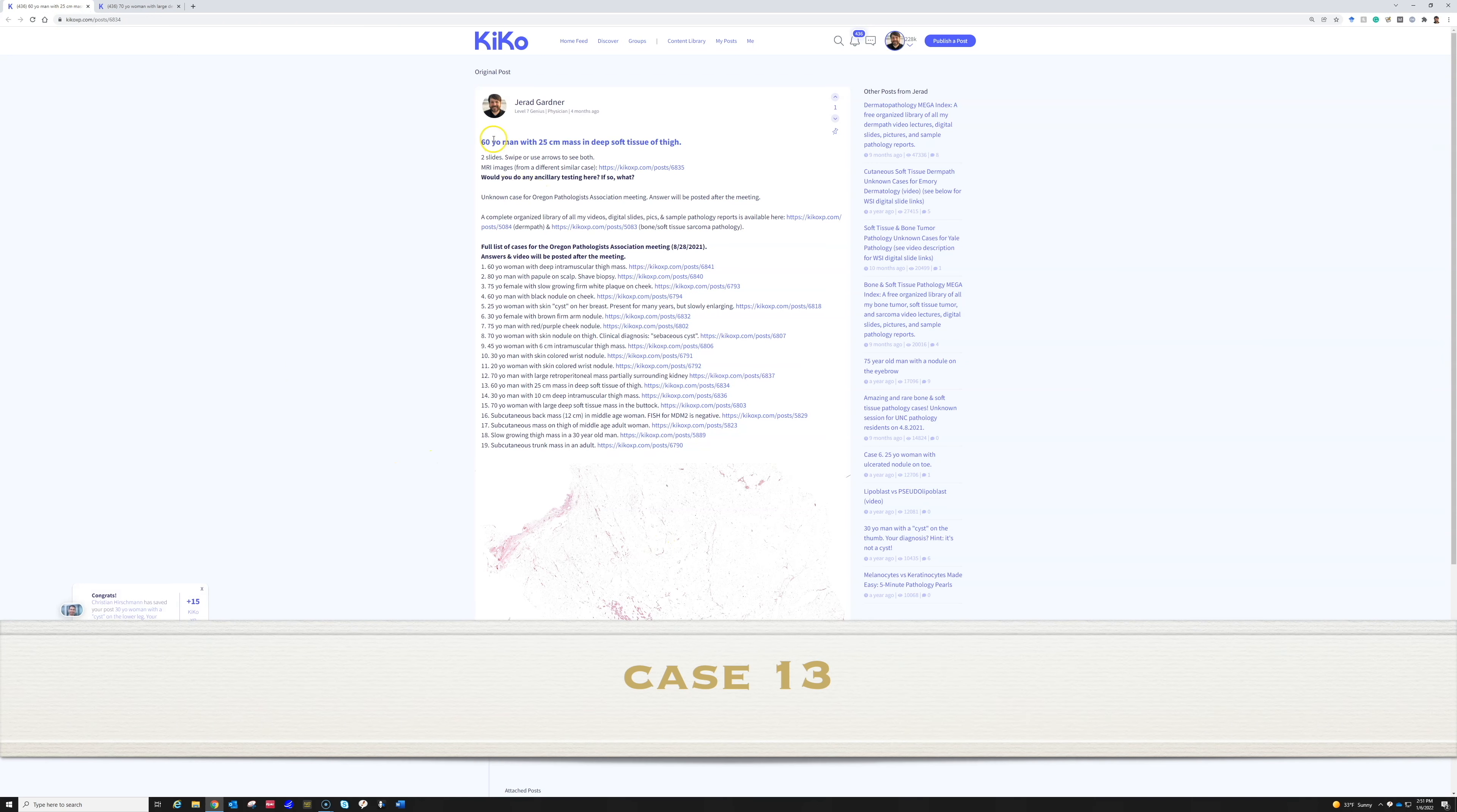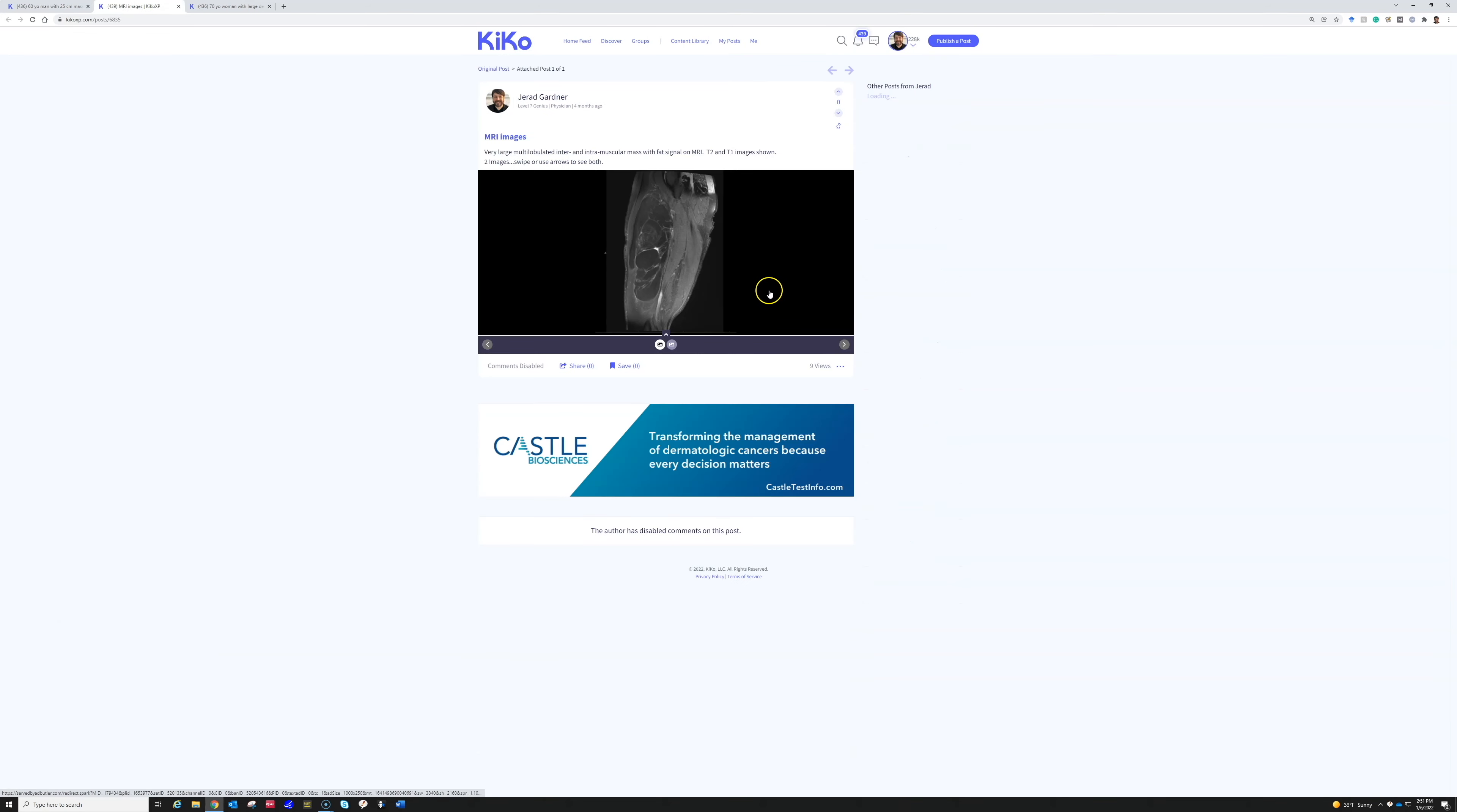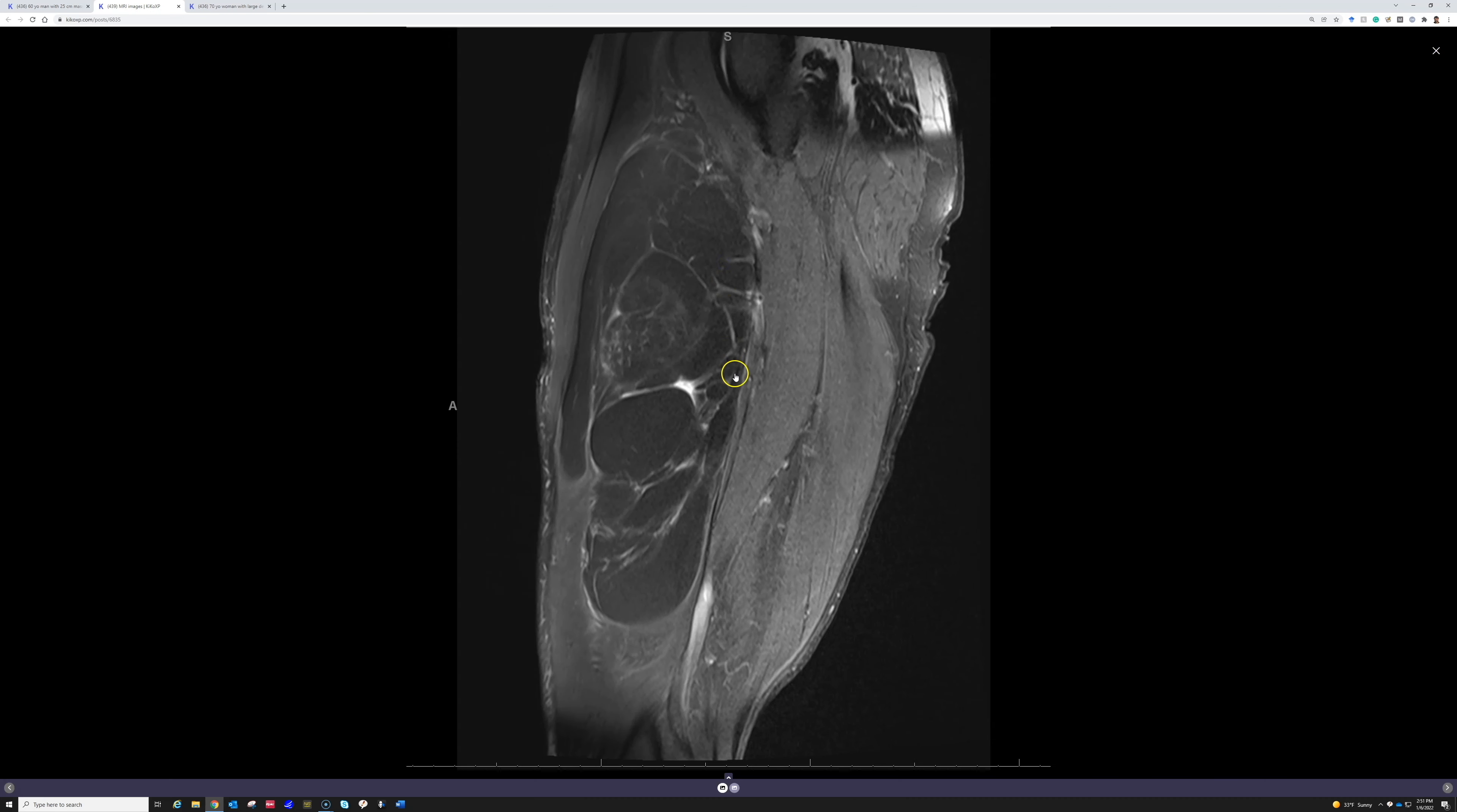And then here is a 60-year-old man with a 25-centimeter mass in the deep soft tissue of the thigh, very big. And here's another case that had an example. Here's a large fatty tumor and you can see that it's lobules and there are these bands of fibrous tissue subdividing the lobules of fat.